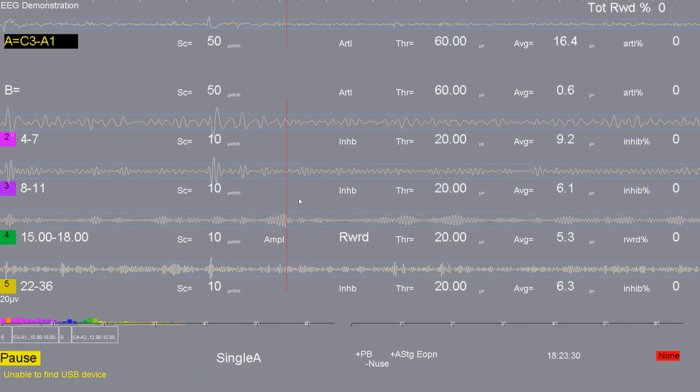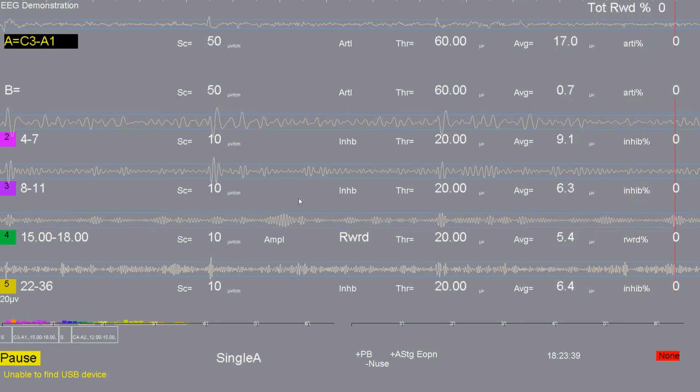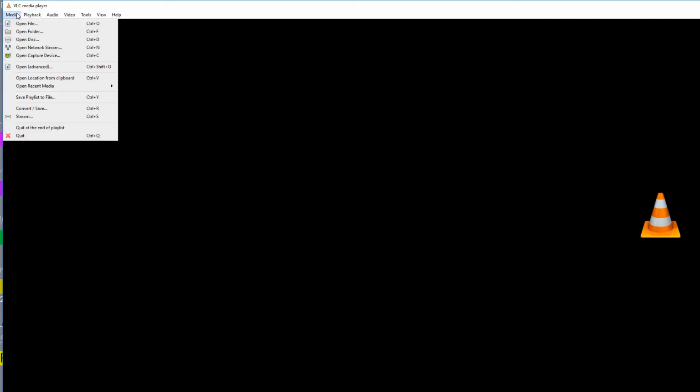So the last thing for you to try is, instead of having the DVD in the drive and opening up EEGer, getting to this point, you get to this point and then you put the DVD in the drive. And then once you've done that, you'll need to go to Media and then Open Disk.